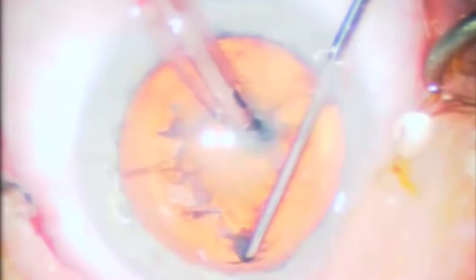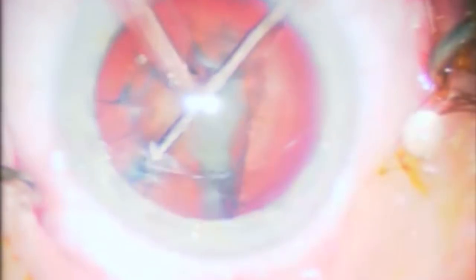We'll then ask the assistant for the chopper. Again, this is a horizontal chopper. We'll touch the nucleus and then push it out over the edge. You'll see the chopper drop in, and once it's placed, chop straight into the pre-placed tunnel. Then split it — make sure that it's totally split with no more adhesions. Without moving the phaco tip, chop out the next segment and then it's free. If there's a little attachment when you first try to grab it, you can just go back right into the trough and split to make sure they're totally separated. Confirm that visually, and then pull out the first piece to emulsify. Then this process is repeated.